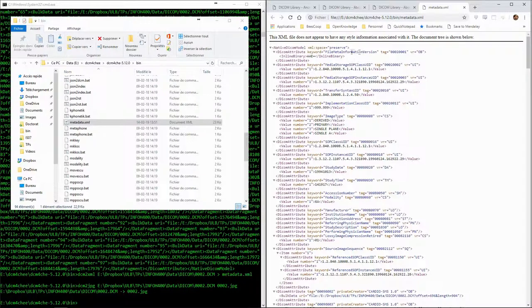And we can also open the metadata.xml file, for instance in a browser, and see again the same information, but this time in XML format.